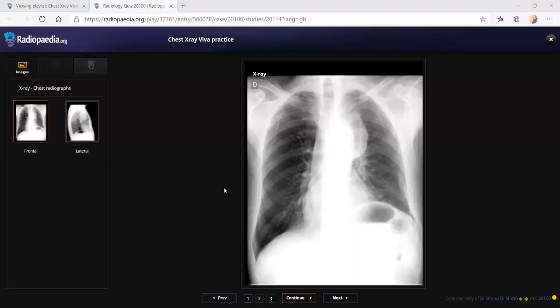Okay, sure. So I'm thinking that it is a superior mediastinal lesion, which can possibly be a lymphoma or some lymphatic proliferation. Since it is not contiguous with the neck, I'm not thinking of a thyroid enlargement. Another possibility can be a lesion coming from a thymoma, but it does not look that much enlarged. In my usual practice, I like to compare with the previous radiographs to see if there is any progression in the lesion.